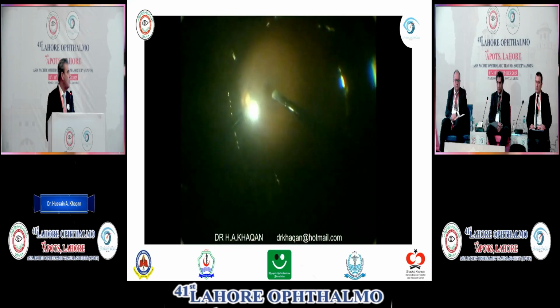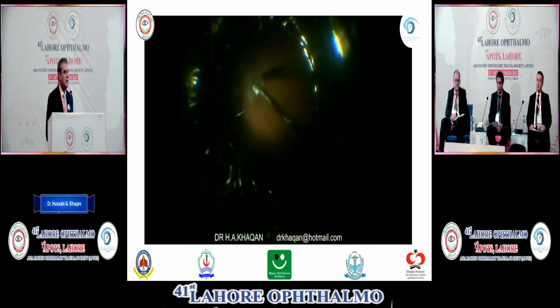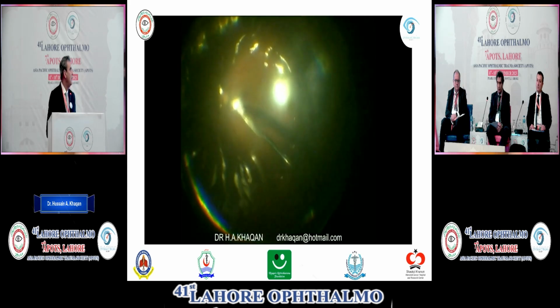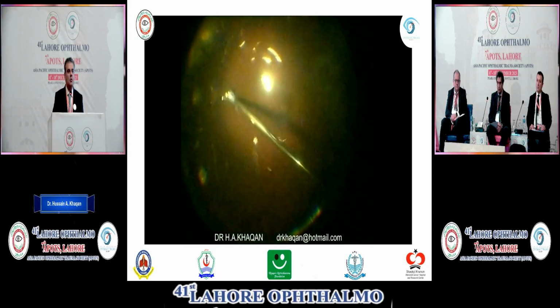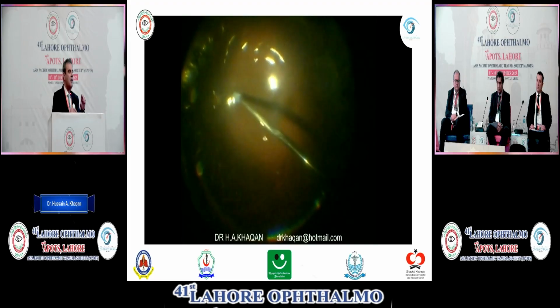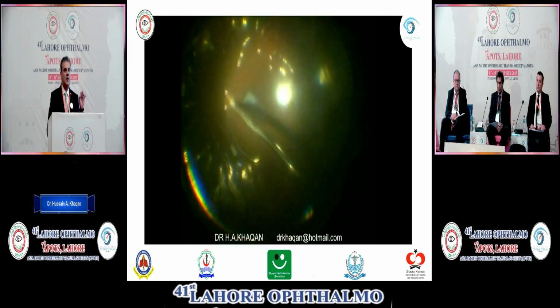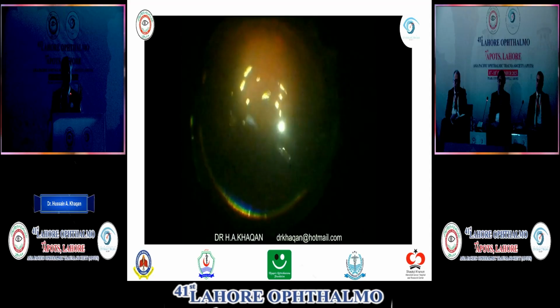This is amniotic membrane graft, and my technique is I will just drop it near the macular hole, no PFCL, nothing, it's just under the air. Then with a soft tip extrusion needle, I will drag it over the macular hole. Our technique is not to tuck, not to plug it. When you plug the macular hole, you are just doing a failed macular hole surgery. You are not letting the neural tissue do its centripetal movement to close. Plugging and closure is nothing.